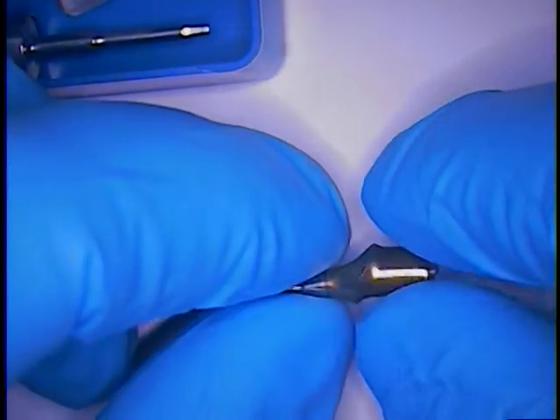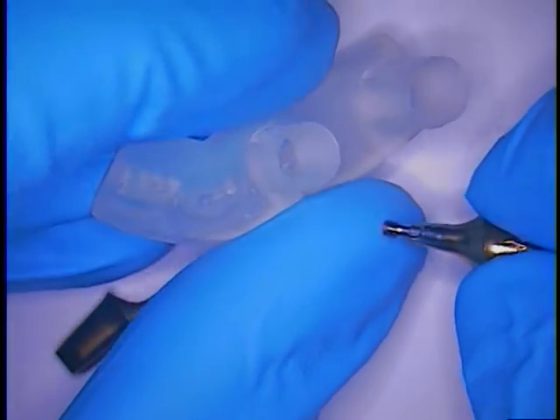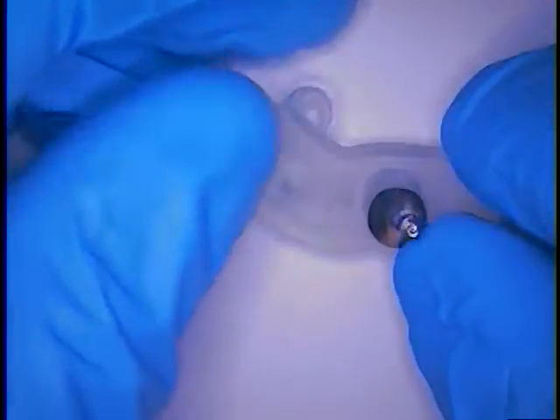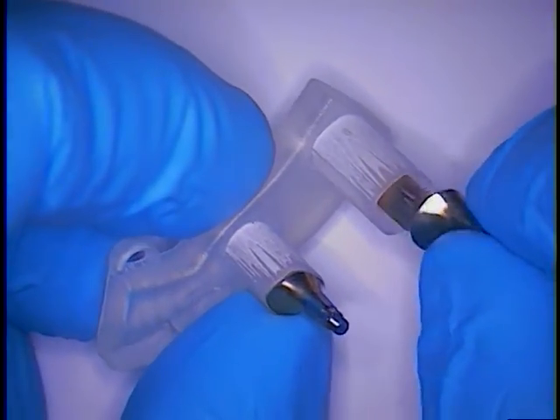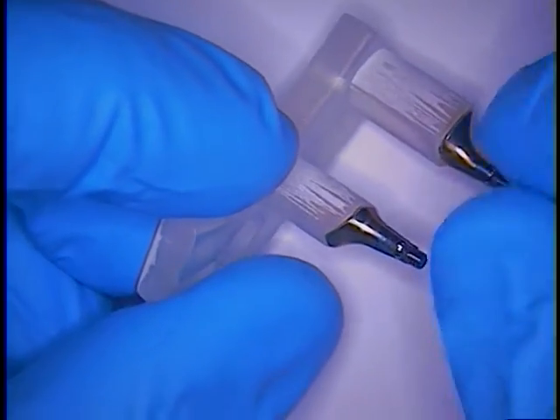It is a very friction grip kind of implant. For that we use a printed try-in index. Each one of these components fit inside of this, and I can show you how that works. This slides in there, that slides in there. So it makes trying in the mouth very easy and also proves that your impression that you've taken is precise.